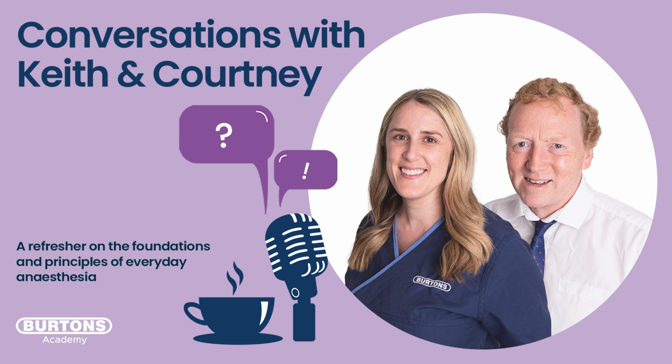We've talked about our pulse ox, and you can confirm it with your blood gas. You can do the same with capnography, confirm it with your blood gas. And one of my favorite things, and it's very much a luxury, is to know the percentage of oxygen I am delivering to my patient. It isn't just that flow meter. What's the flow meter set at?